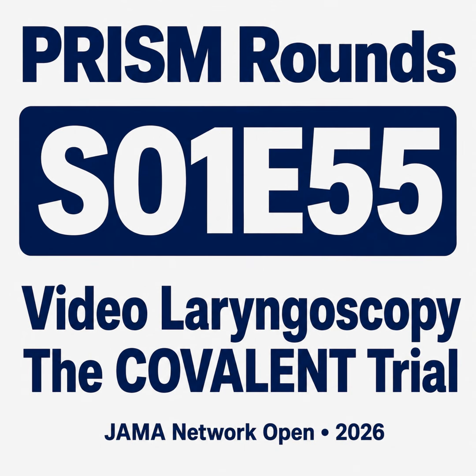As we wrap up this deep dive, I want to distill this massive trial, the complex statistics, and the editorial context into 3 concise, highly memorable takeaways that you can carry straight into your next clinical shift. Sounds good. Number 1, the COVALENT trial provides strong, randomized, pragmatic evidence that video laryngoscopy significantly improved first-pass success compared to traditional direct laryngoscopy during routine perioperative intubations.